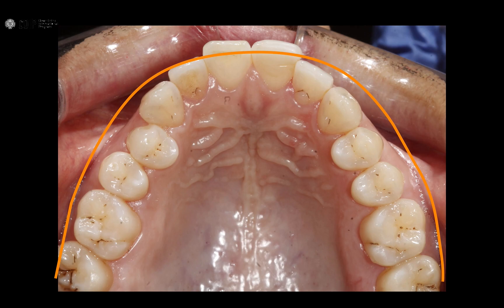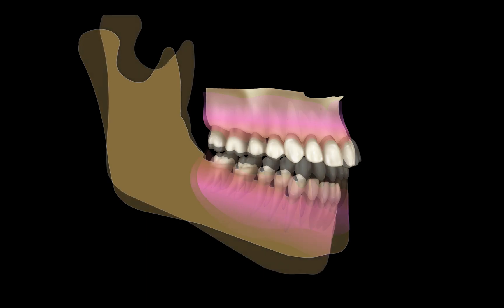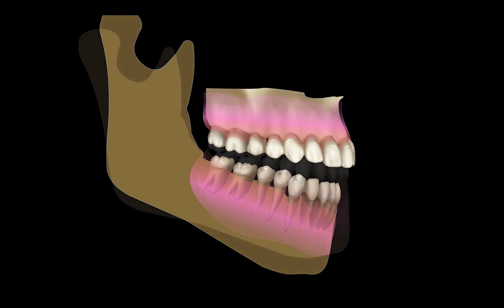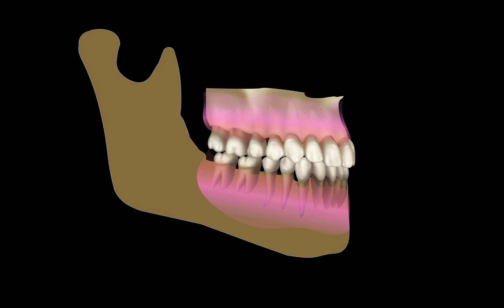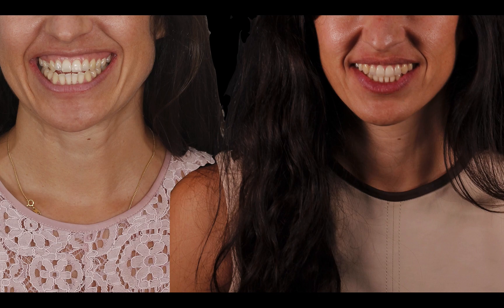I analyze everything and I see the arch. Analyzing the ideal arch that I want to achieve in this space, I see the amount of space that I'm losing in the posterior part because of the narrow arch. So this is the way I'm going to plan the case. I'm going to work in the transversal plane before thinking about any vertical movement. The idea is: where we have an open bite, what I want is to do a posterior intrusion, and after that, to allow the mandible to autorotate to solve the open bite. If I do that, I can close the open bite.